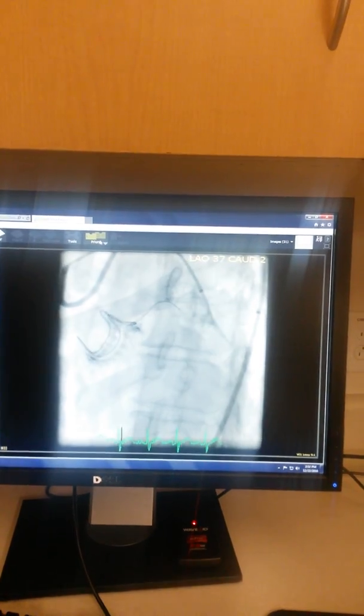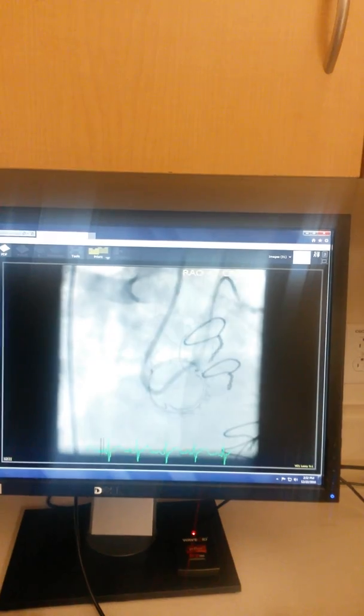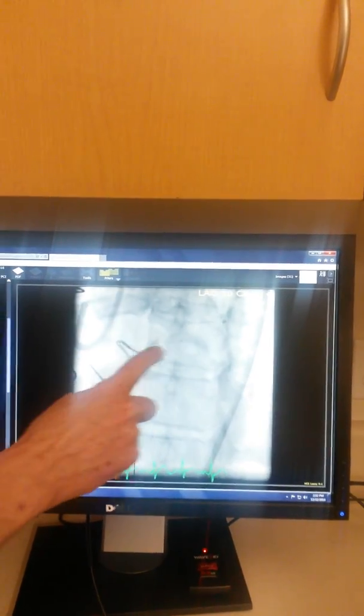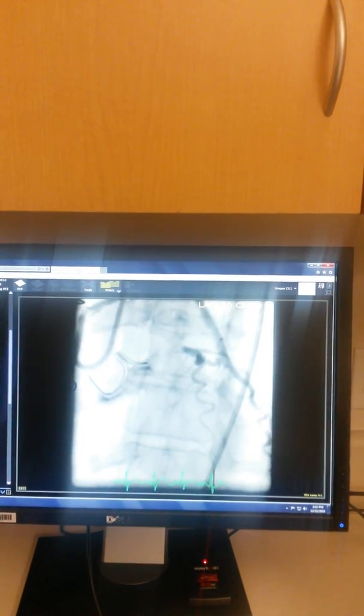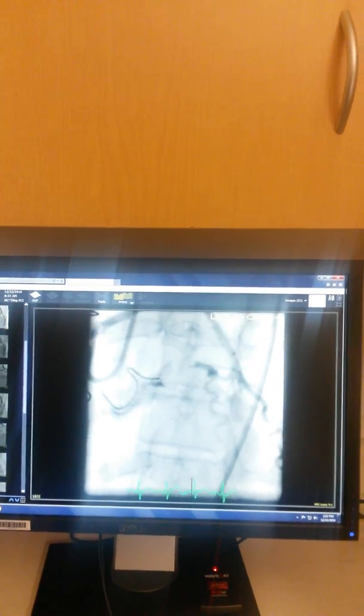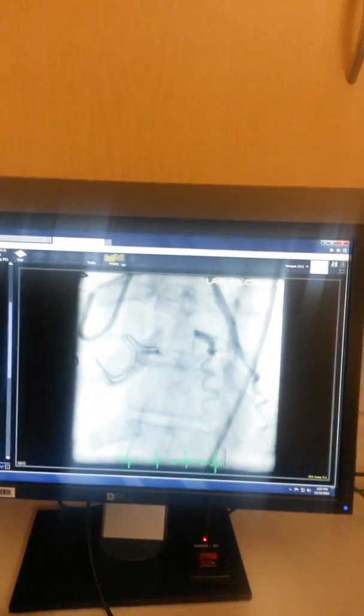So I go in now with — these are different views of the same thing. This right here, these two markers are the angioplasty balloon, and I use this to figure out what length of stent we needed. We have different lengths of stent available. That's a 15 millimeter balloon; we ended up using a 16 millimeter stent.